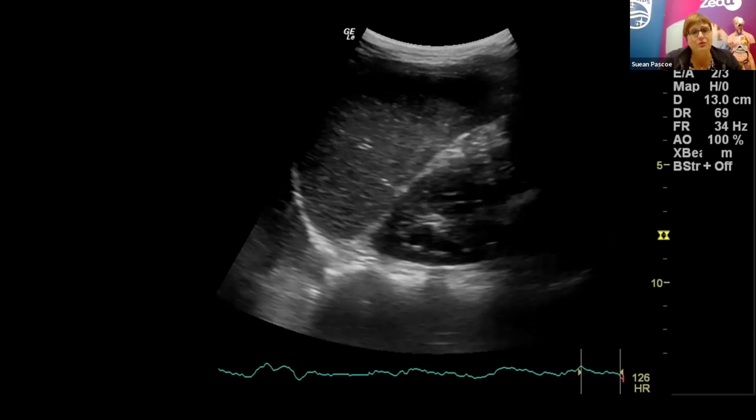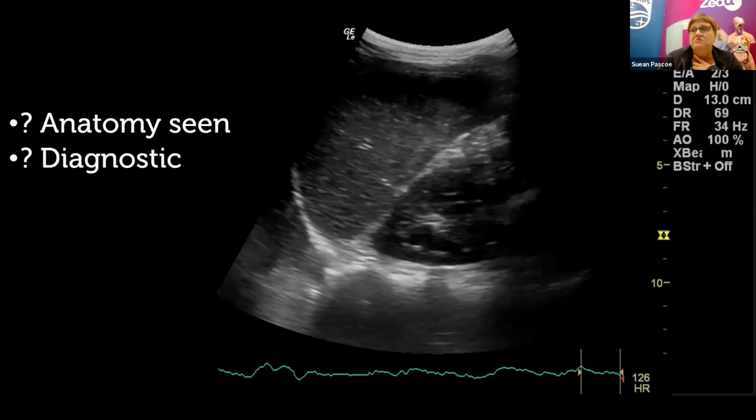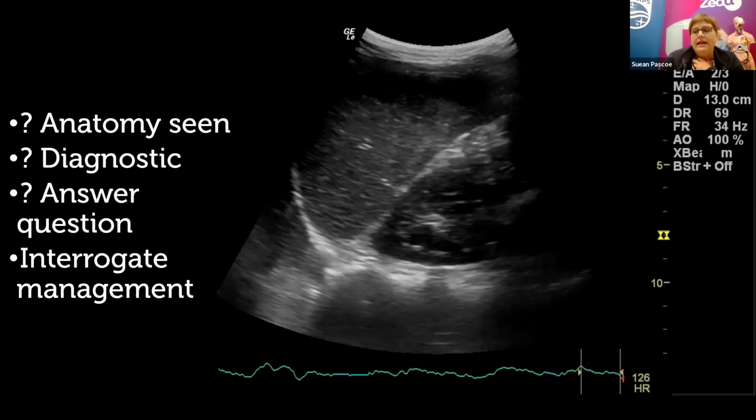If your gain is set too bright, you potentially write echoes in and obliterate an area of free fluid. So those imaging parameters are important to take a backward step and then come forwards again to look and say, with the question that we had in mind, does this picture let me answer that question? So we're looking now, have we seen the anatomy that we need to see? Is the picture in fact diagnostic? Does it answer the question? And does it work for the management? How do you integrate it with your patient management?